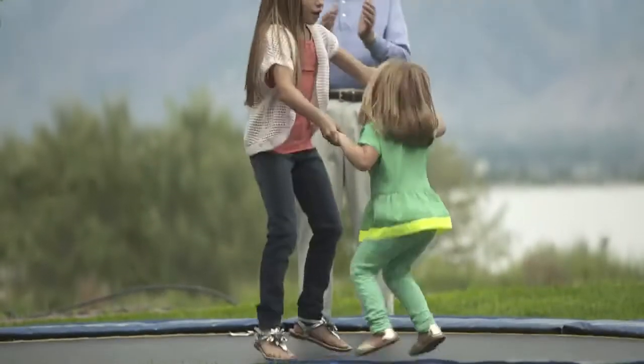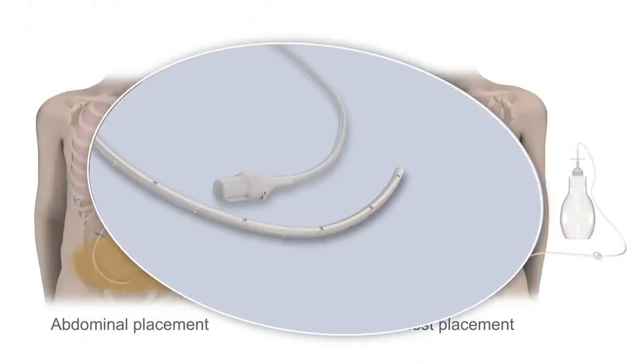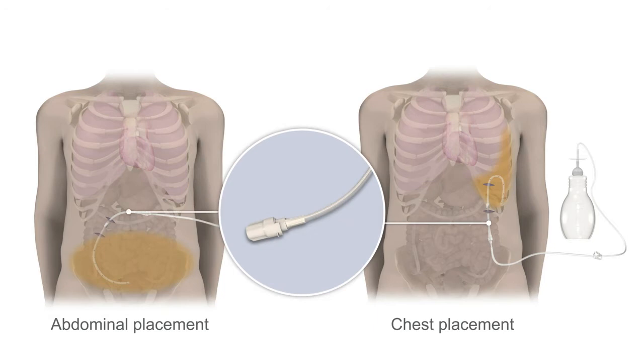Before you begin, read the full instructions for use that come with the drainage kits and follow these instructions every time you drain fluid. This is the PleurX catheter. Part of the catheter stays inside your body, either in your chest or in your abdomen. There are holes in this portion of the catheter that allow fluid to enter. The white cuff in the middle is part of the internal portion of the catheter and should not be visible outside your body. The end of the catheter stays outside your body so you can drain fluid. A valve on the end of the catheter helps keep fluid from leaking. It also prevents air from entering the catheter.